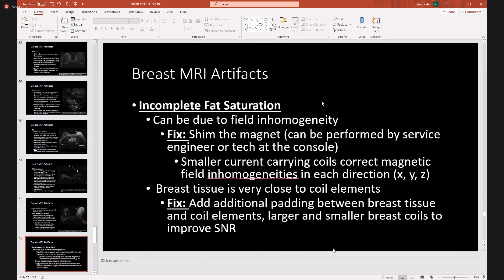Incomplete fat saturation can also be due to magnetic field inhomogeneity. To fix that, you can shim the magnet, which can be performed by your service engineer or tech at the console. Breast tissue can also be very close to your coil elements, which can cause incomplete fat saturation. You can add additional padding between the breast tissue and coil elements, and use larger or smaller breast coils to also improve your signal-to-noise ratio.